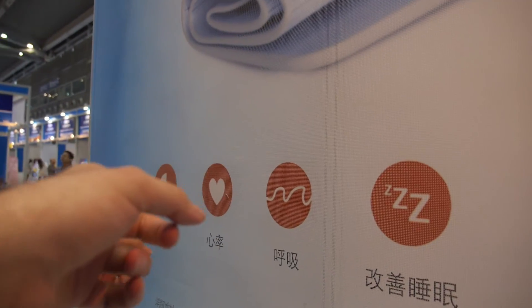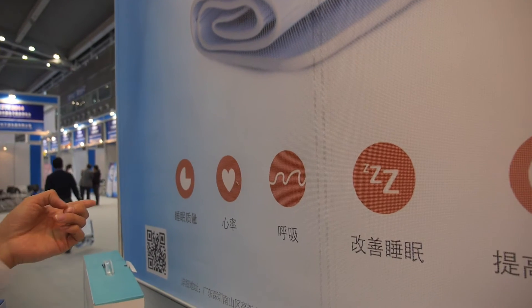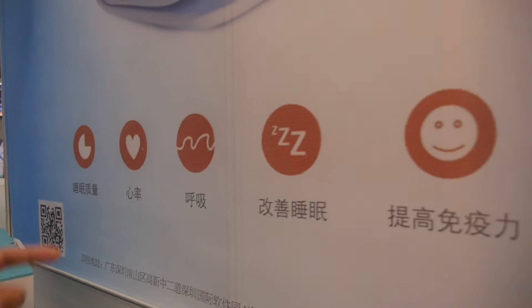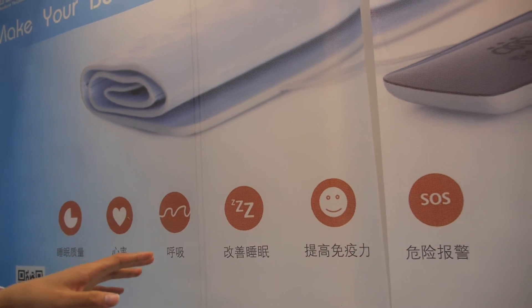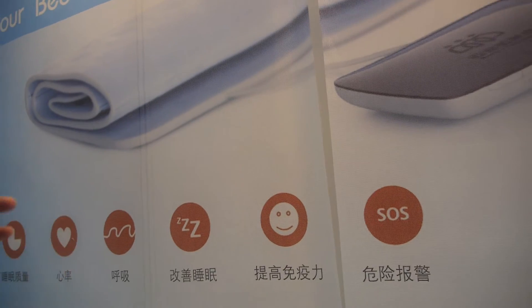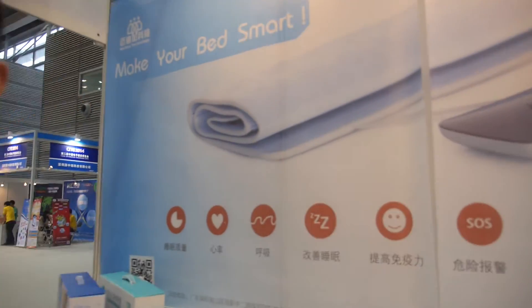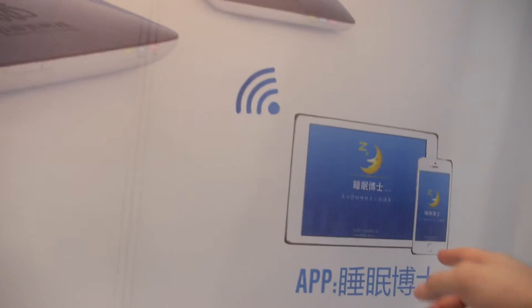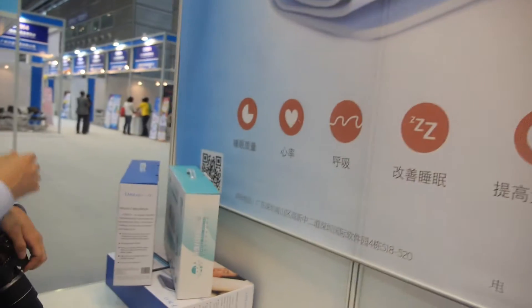This shows the functions: the heart rate, the breathing, and the sleep quality. It can help improve your sleep quality. If the person's heart rate or breathing is lower or higher than a specific level, it will alert. There is an SOS alert built into the application.